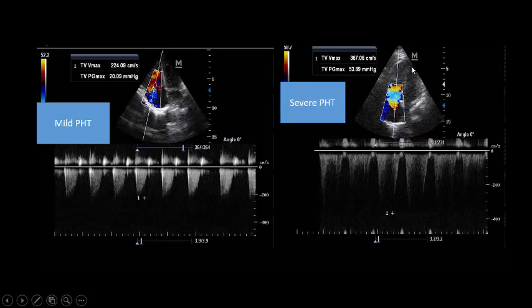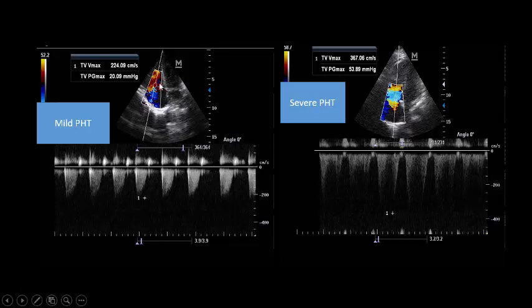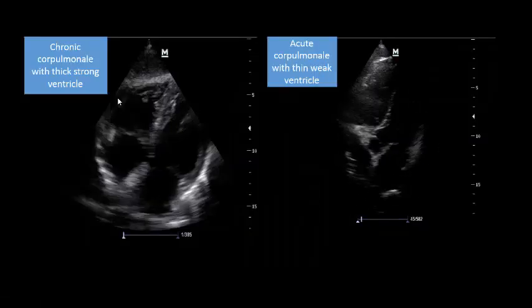In chronic cor pulmonale, with a compensated strong RV, the peak systolic tricuspid regurgitation gradient is more than 60 mmHg — if you add the IVC pressure of 15 mmHg, the total pulmonary artery systolic pressure exceeds 60 mmHg. This is because the RV is now strong enough to generate pressure and flow. In contrast, in acute cor pulmonale with a weak RV, you see very poor tricuspid regurgitation and a very low gradient across the tricuspid valve — less than 60 mmHg. You can clearly see this strong chronic RV in the image.